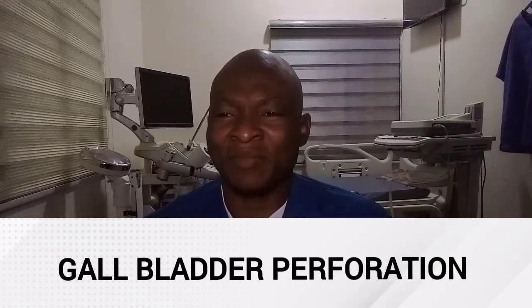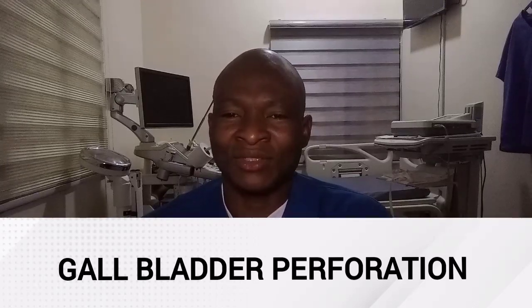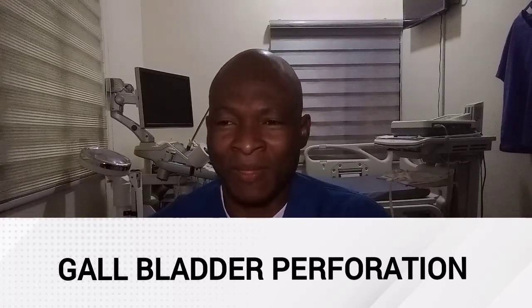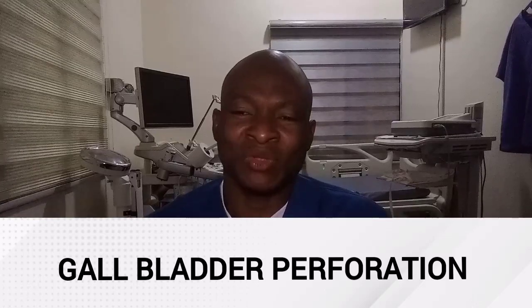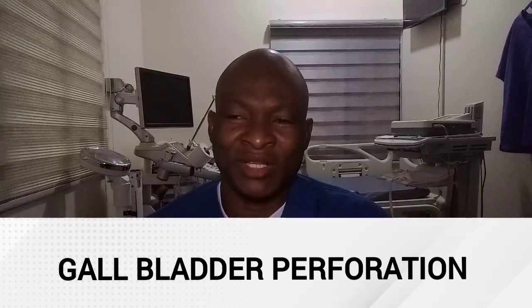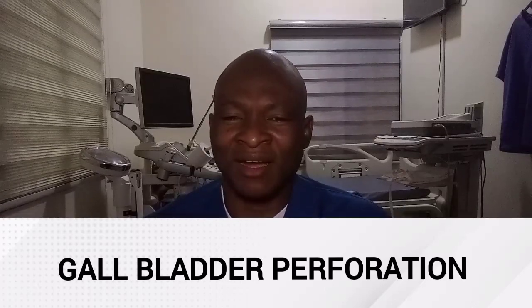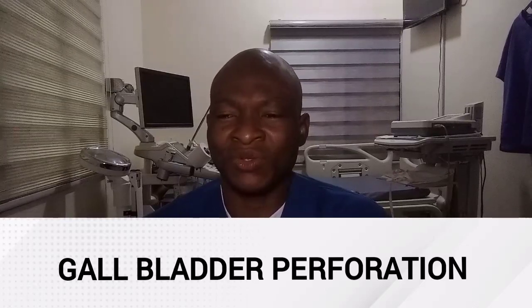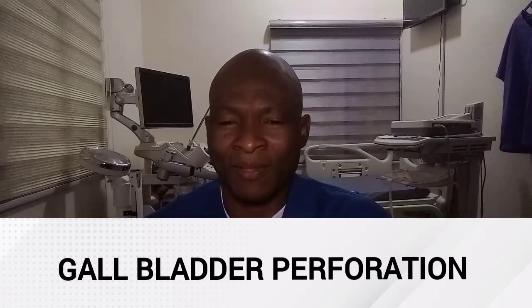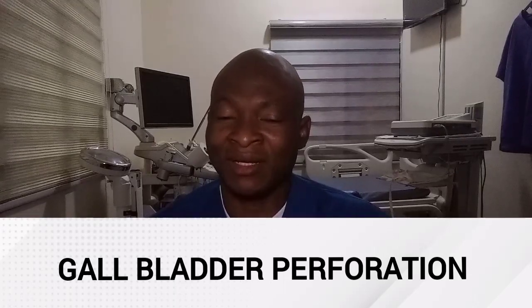Let's look at gallbladder perforations. Most gallbladder perforations are subacute and result in a pericholecystic abscess collection adjacent to the fundus, the region with the sparsest blood supply. Sonographic appearances: you'll find a complex pericholecystic fluid collection with septations, and a non-visible gallbladder due to fluid collection around the gallbladder.